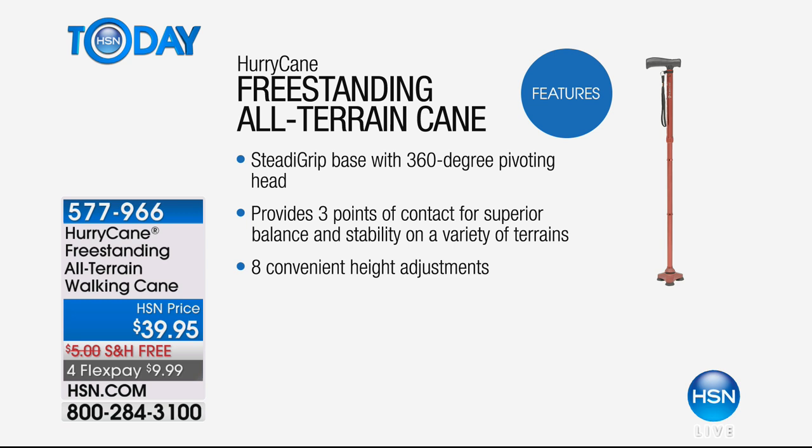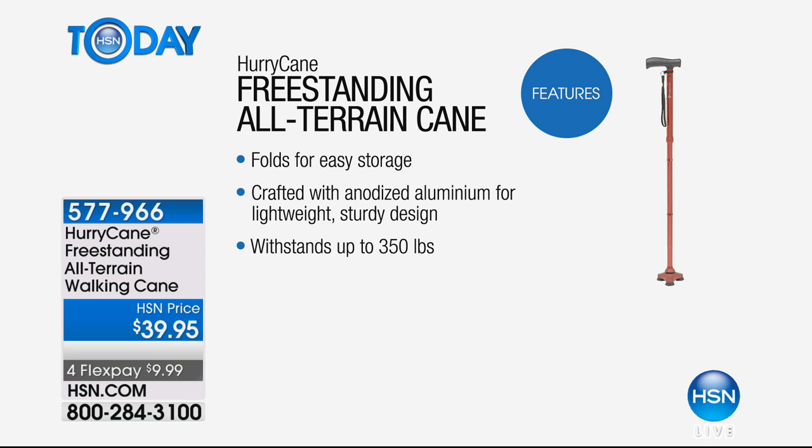This will hold up to 350 pounds. There are three points of contact on the base, so it walks almost like a foot does — you go from heel to toe, so it allows you to be comfortable and secure. Anodized aluminum, which means it's super lightweight. This is the kind of material they make airplanes out of — they use it because it's strong but very, very lightweight.